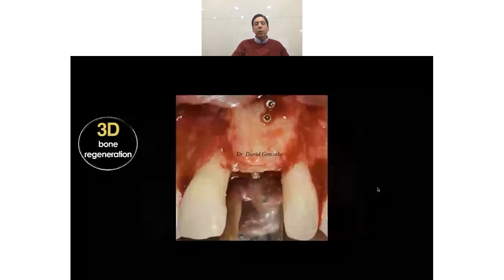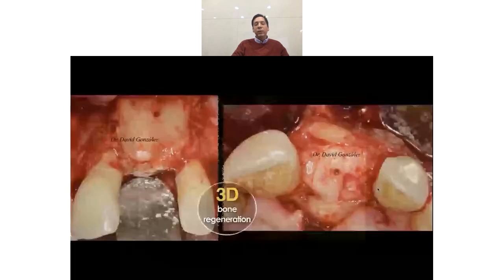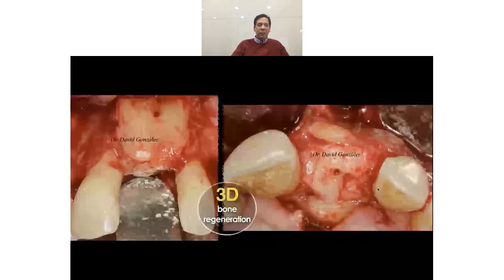Many views of the bone, the incisal view. And this is after removing the screws, we see the stability. Remember, I left it for 6 months. I don't like the 4 months very much.